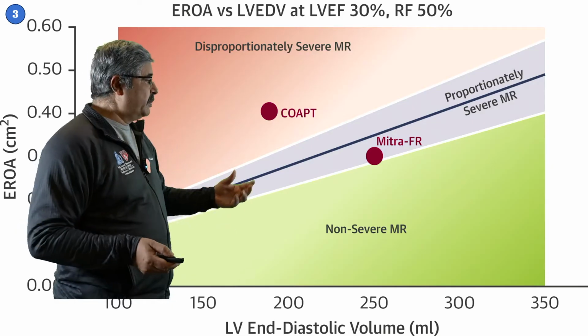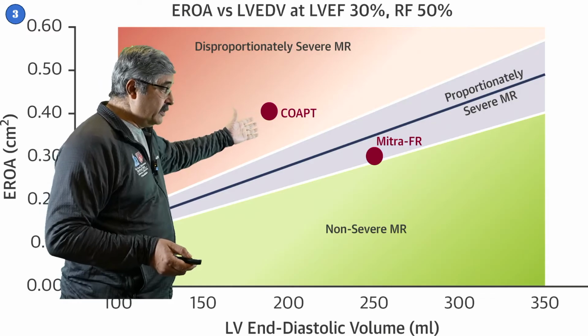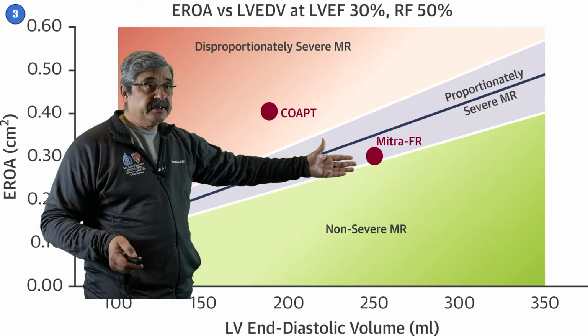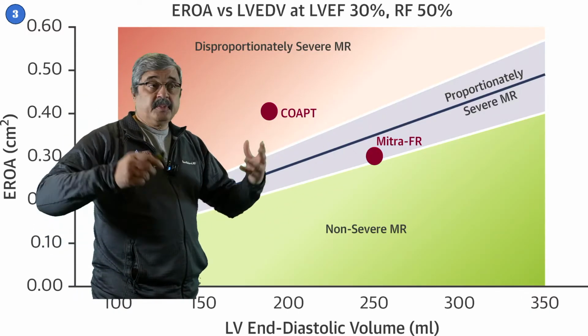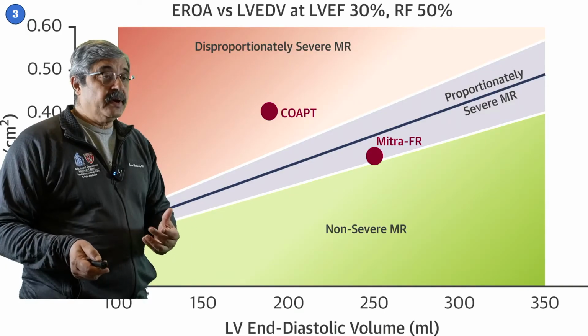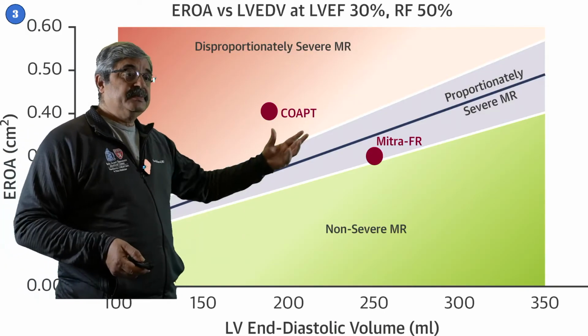So therefore, patients who have disproportionate MR, which means part of the reason for mitral regurgitation is the leaflet problems, actually did better with MitraClip, as opposed to the Mitra-FR trial, in which the LVs were very large and they had proportional mitral regurgitation, and even if you did anything to the leaflets, that wouldn't do anything at all to the outcome. So that's why they did not have as great an outcome as patients in the COAPT trial.